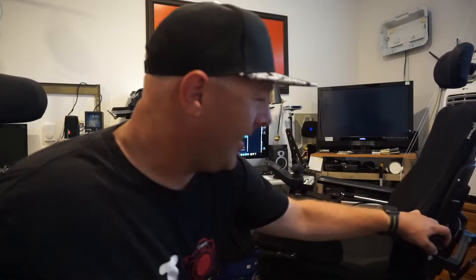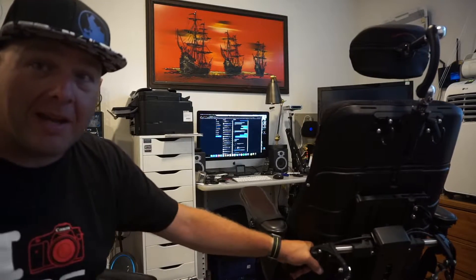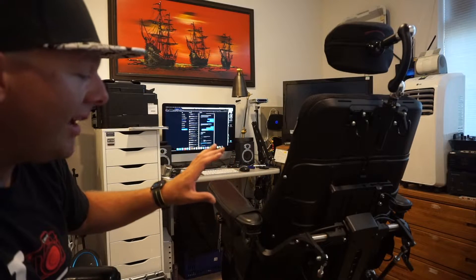Just in case you're wondering — people always ask why I do so many Permobil videos and not repairs on other chairs. Well, first off, all Permobil chairs are pretty much the same. They all have this sort of standard 3G seating with different sizes and adjustments, but unlike other chairs, all these components are essentially interchangeable. I've also got like 17 Permobils, so at any given point there's always going to be one that needs repair or adjustment. The F3 here is fine — I just want to show you guys how to adjust these.